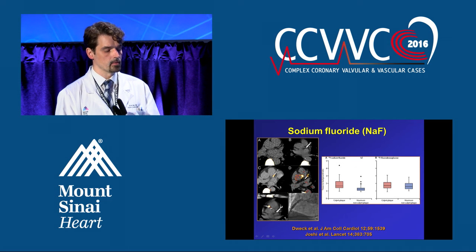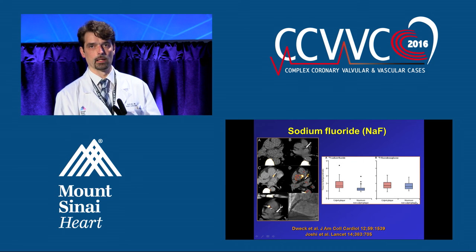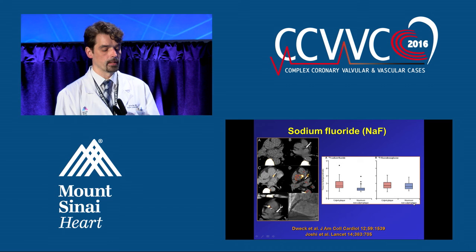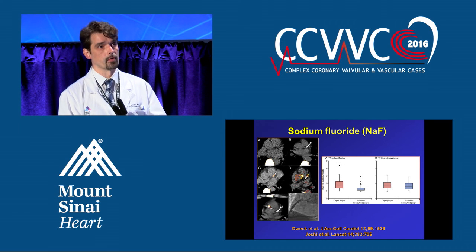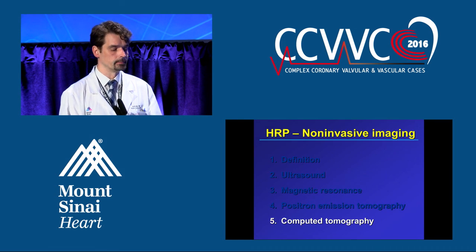And in this particular study, which is one of the first ones published in the Lancet, what you can see is, when you compare, these are patients that had a heart attack, and the uptakes were comparing the culprit plaque and other plaques that were not the culprit. So you can see that the FDG, the inflammation, was similar, but the amount of uptake of the sodium fluoride was increased. So again, very preliminary data, but perhaps those microcalcifications that we're talking about, we can detect them with this isotope better, because sometimes they are too small to see visually. So maybe we can detect them better because that's when the calcium is forming, not when the calcium has already stabilized.